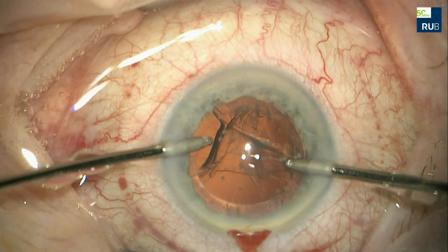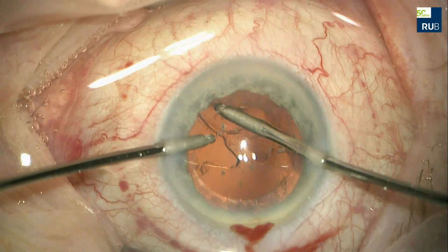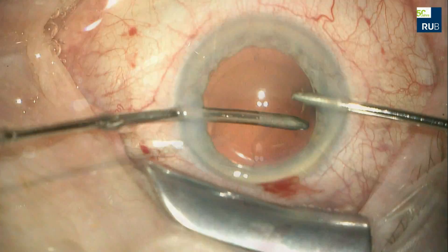Using a bi-manual technique, cortical cleanup with irrigation and aspiration is performed.